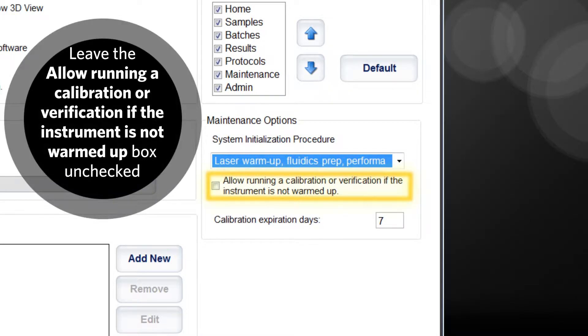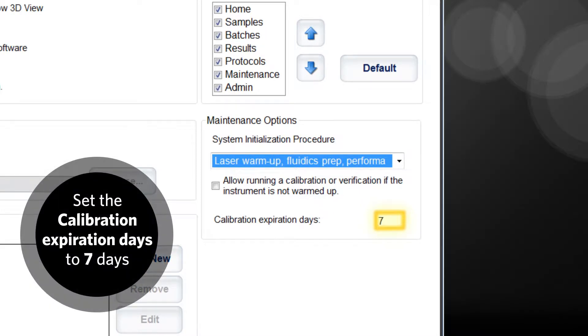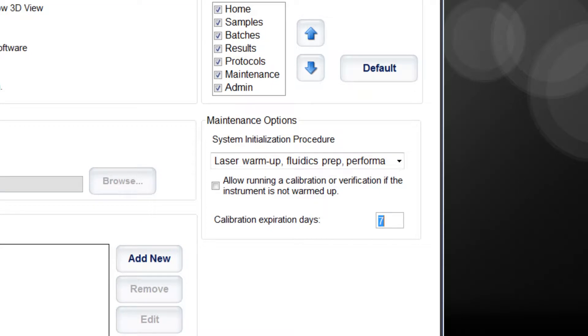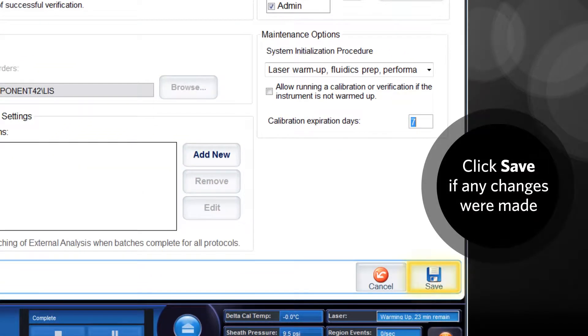Leave the 'allow running a calibration or verification if the instrument is not warmed up' box unchecked. In the calibration expiration days box, verify that it is set for seven days per Luminex recommendation. If not, enter seven into the box. This will ensure the system runs a calibration with the performance verification automatically once a week. Note: you may set this number higher or lower depending on your laboratory's standard operating procedure.